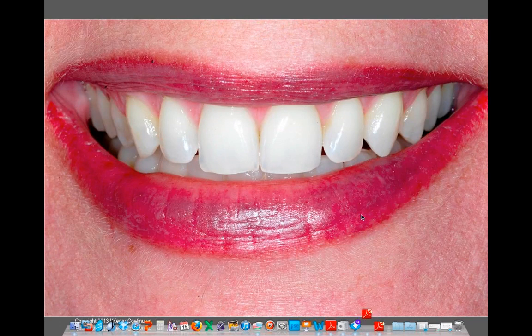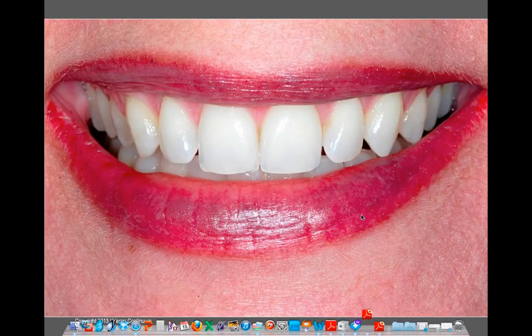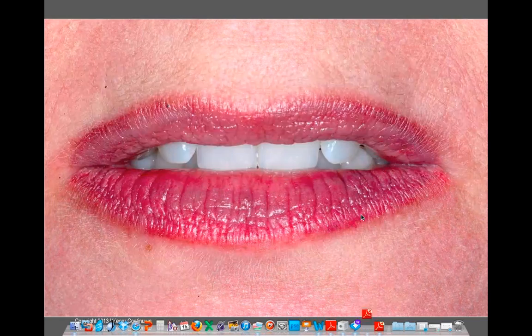The problem is, I want to see lip mobility, and these are taken at the same magnification. So it's important that you take this shot first, fill the screen, and then don't do anything. Just have them say the word Emma, like the girl's name, Emma. Or they can lick their teeth and just relax. But if you've ever read any of the articles on incisal edge at repose, at least in my office, this was a starting point for the restorative algorithm.